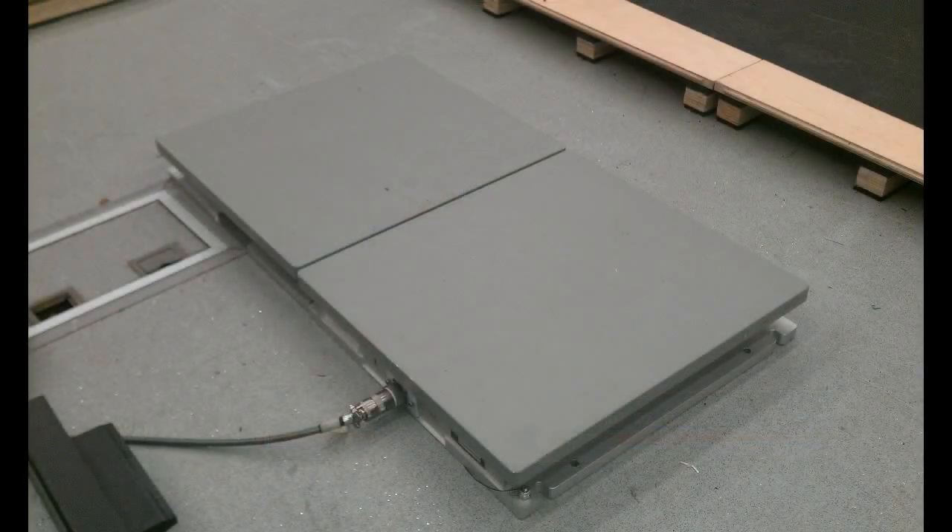Embedded in the floor we've got two AMTI force plates which are used to measure ground reaction forces. These force plates can be thought of as very accurate bathroom scales, but unlike bathroom scales they also measure the forces in the plane of the floor as well as normal to the floor.